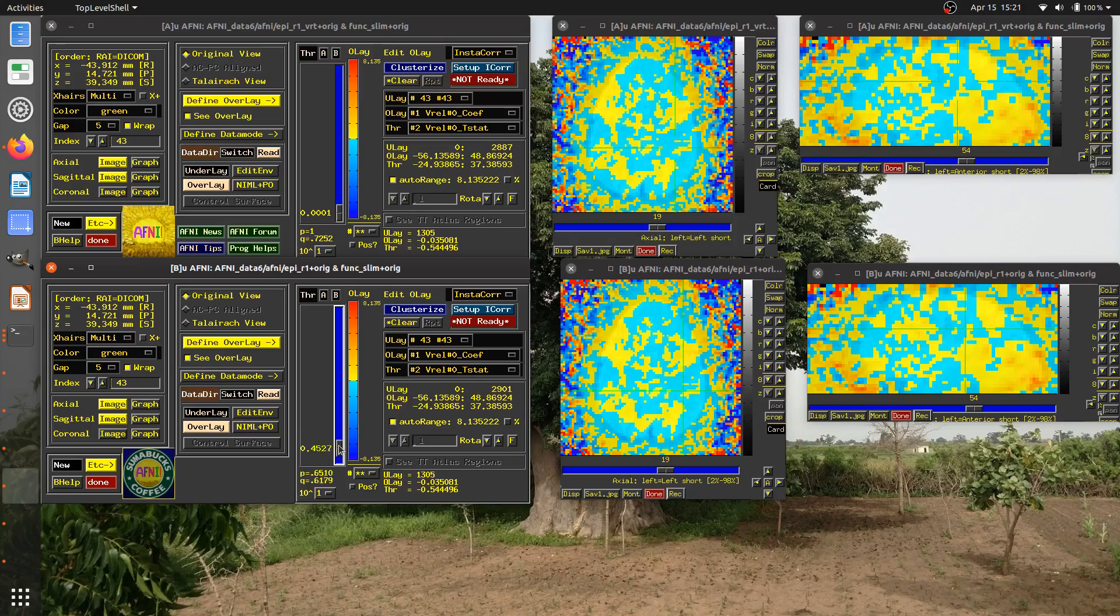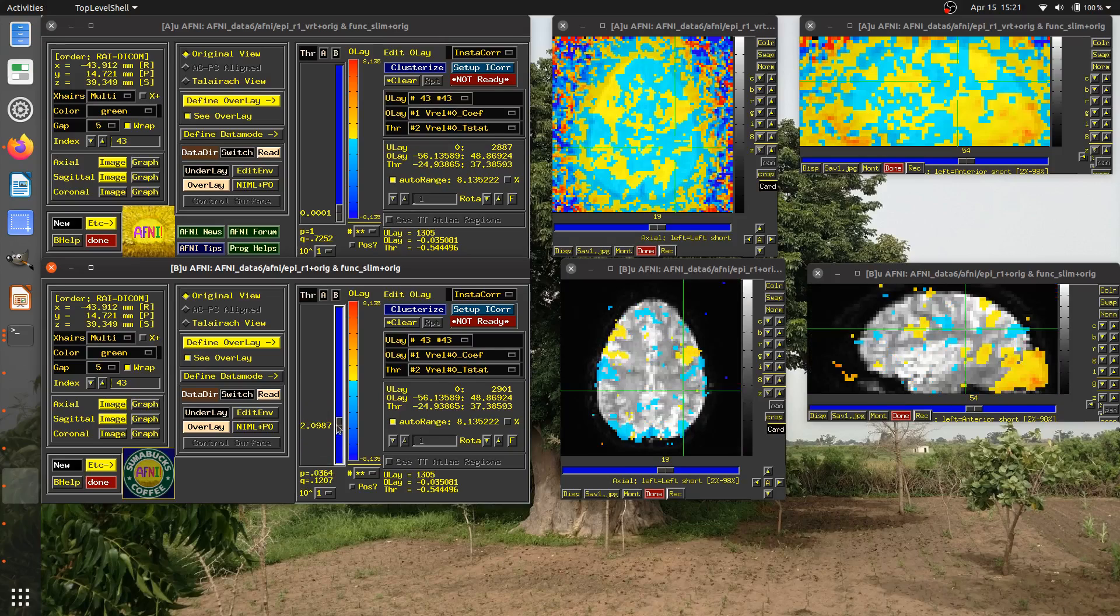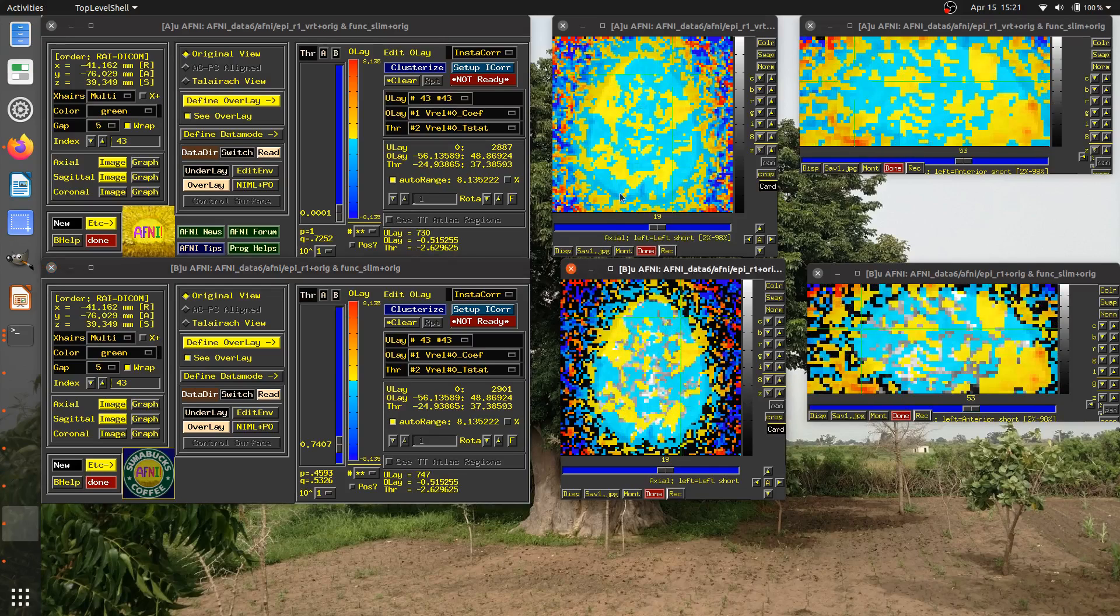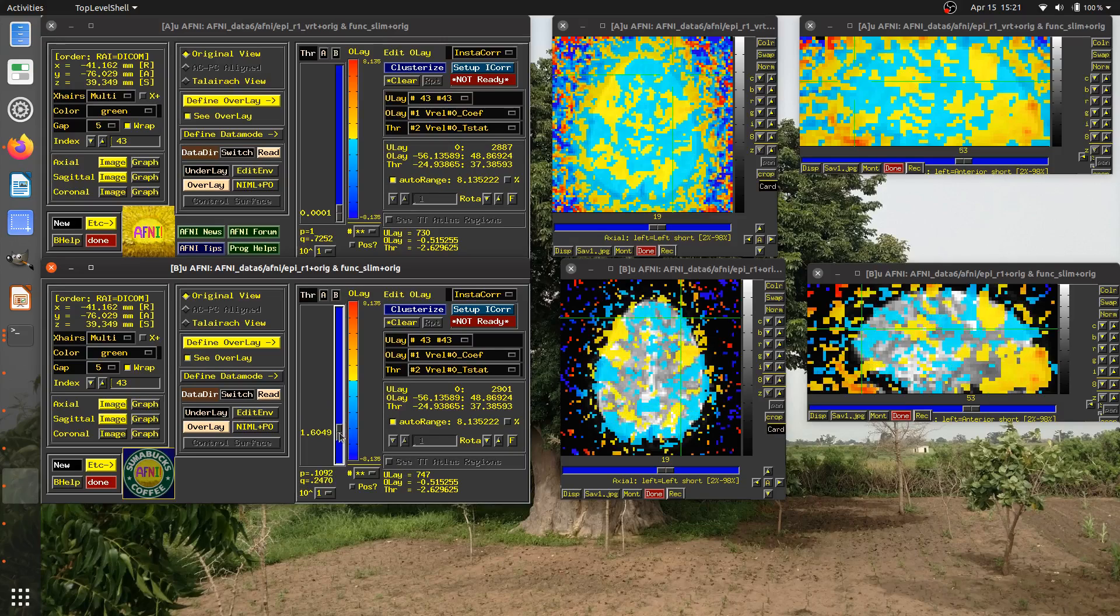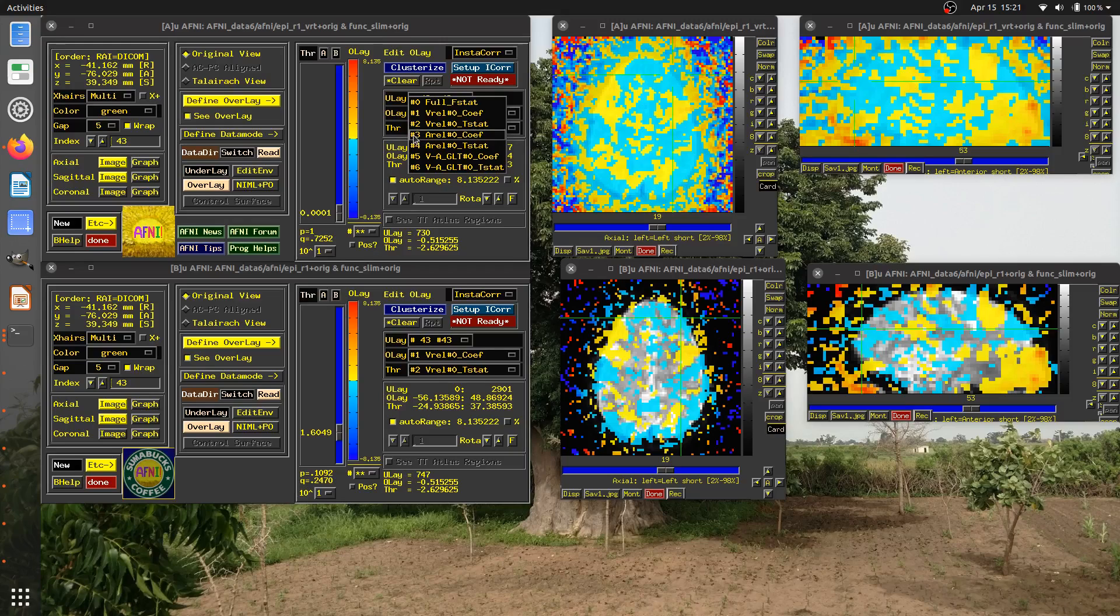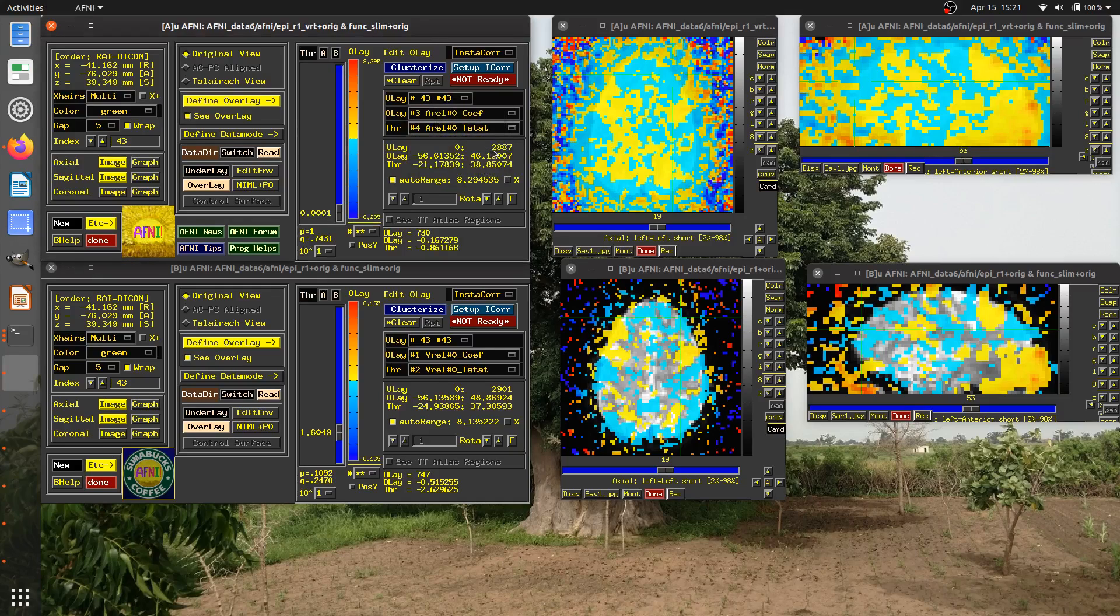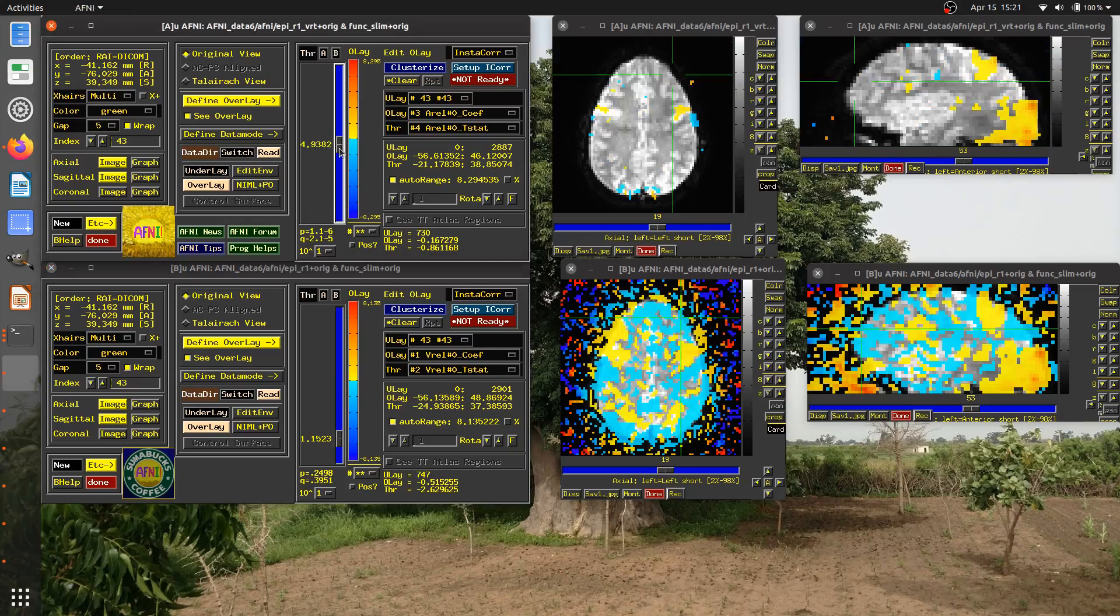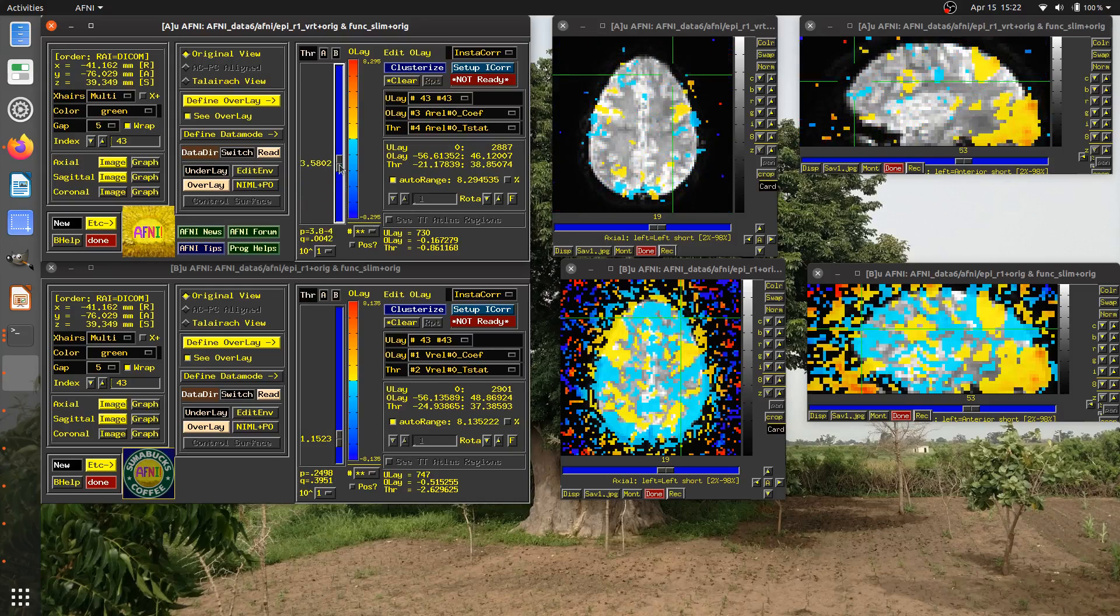Now, if you notice here, they both have the overlay dataset being brick one. And the threshold is the statistic associated with it, which we've talked about in other videos. Why we look at our modeling results this way, when we have both a coefficient and a statistic in our model. In this case for a visual reliable task. If I take this threshold and I increase it, you notice that spatially, these two datasets are still linked, but in terms of the threshold, they're not.